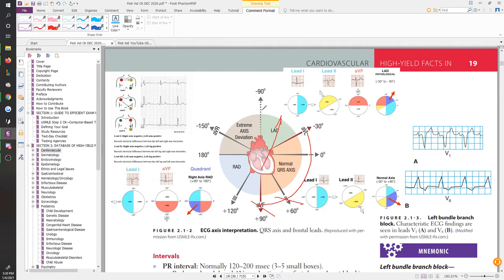So now the new shift would be something like that, right, where it moved over that much. See, so now it's not really using 2 and AVF that well. More electricity is going in that direction as my original red arrow. So you remember how if electricity is moving opposite to where the lead starts pointing downwards.